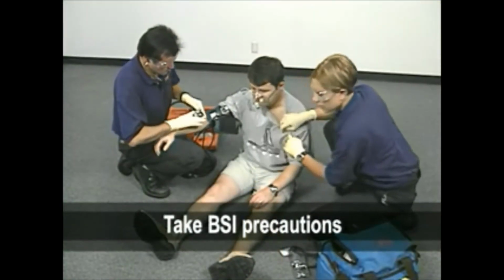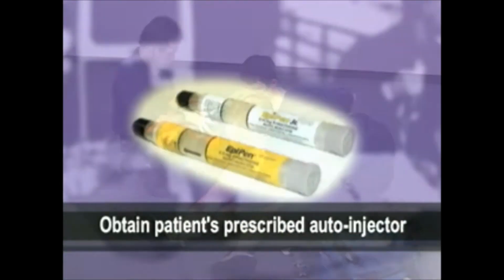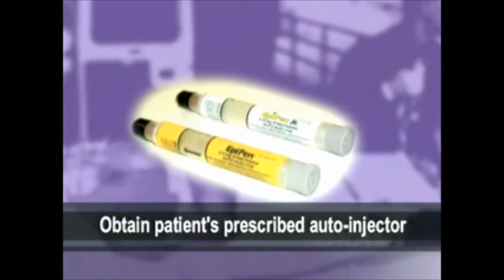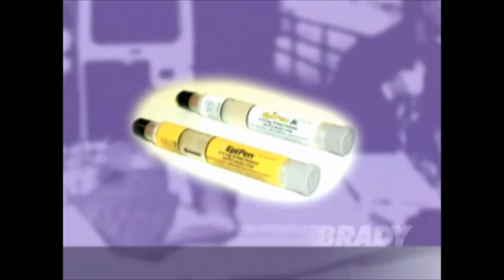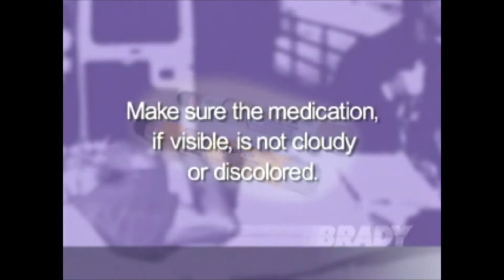If your initial assessment of a patient with an allergic reaction indicates the possible administration of an epinephrine auto-injector, here are the steps to follow. Take BSI precautions. Obtain patient's prescribed auto-injector. Ensure that it is the right medication, the right patient, and the right expiration date. Make sure the medication, if visible, is not cloudy or discolored.